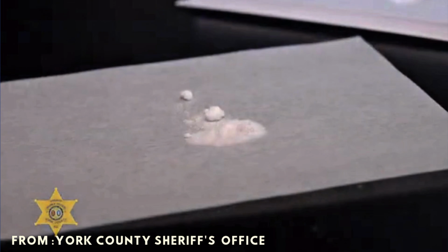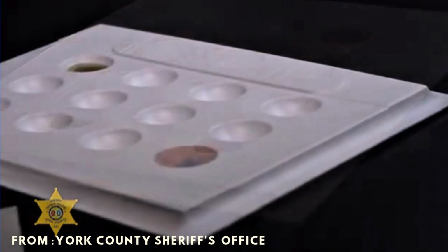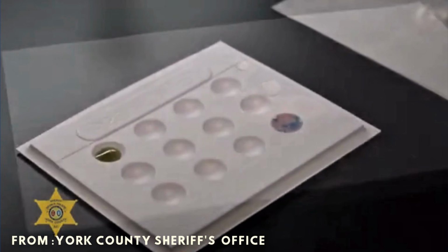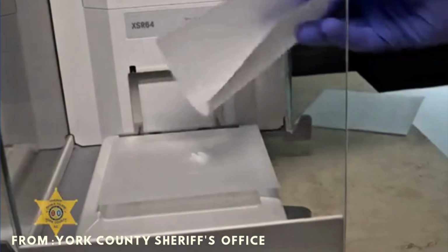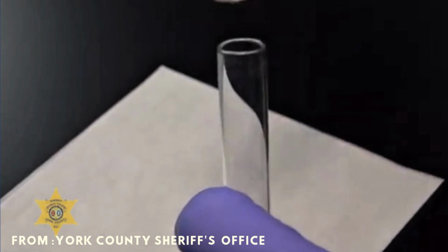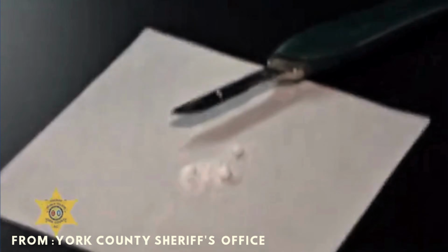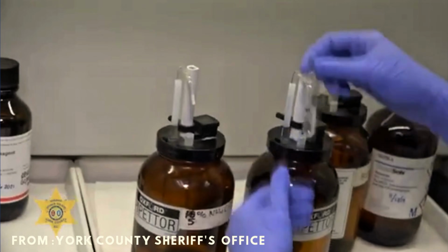The first thing we do is what's called a presumptive test, which is a color test. It gives us an idea of what compound we're looking at. In this case, with this substance, it could possibly be cocaine or various other substances. That's why we call this a presumptive test. The sample for our instrument test, we'll put into a test tube, and then we will extract that in a solvent to dissolve and then place that into a vial.